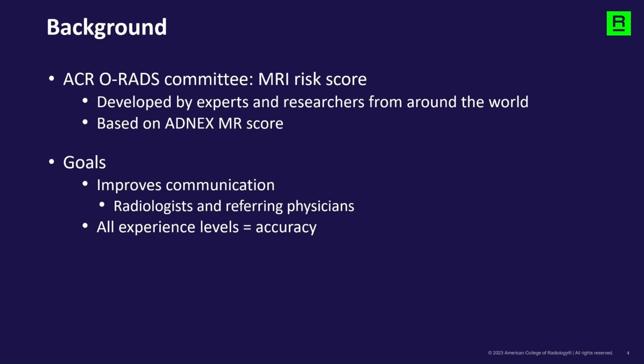The O-Rads process was launched in 2015, and the O-Rads MRI risk score was published in 2020. The goals of using the O-Rads MRI risk score is to improve communication, not just between ourselves as the radiologist, but also with our referring physicians. Radiologists at any level of training can use the O-Rads MRI scoring system, and the ultimate goal is to reduce variation and improve accuracy in reporting. A quantified scoring system also allows for patient outcomes research.